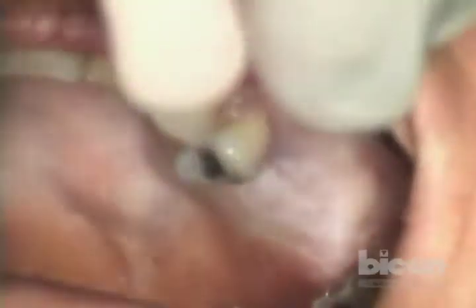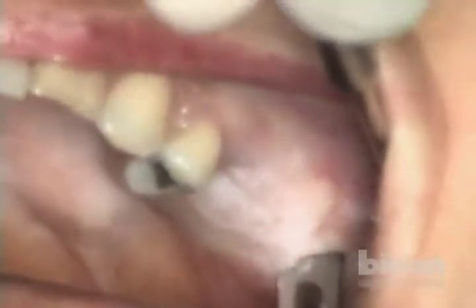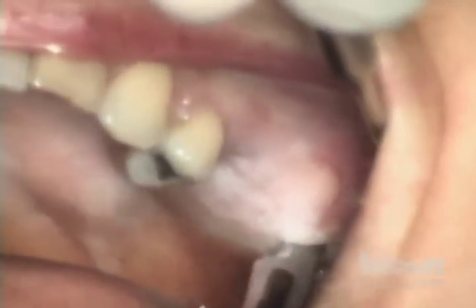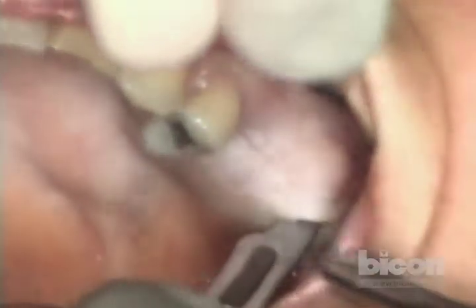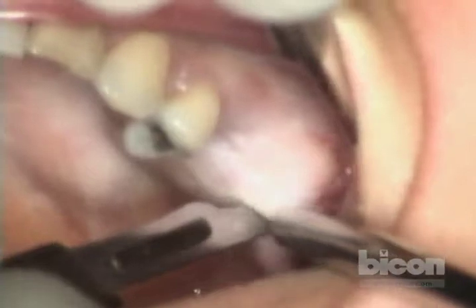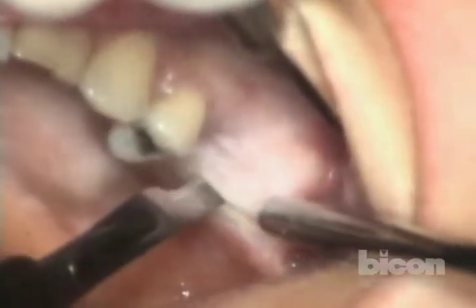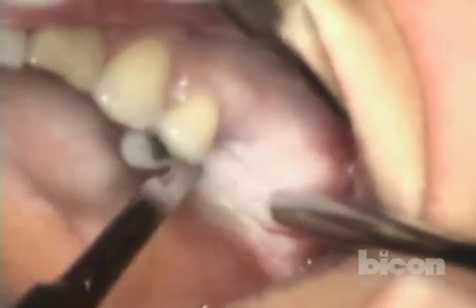It's going to have to be pretty wide because we need to see the whole crest, but you don't want to make it so wide as to cause bleeding from the branches of the greater palatine artery.